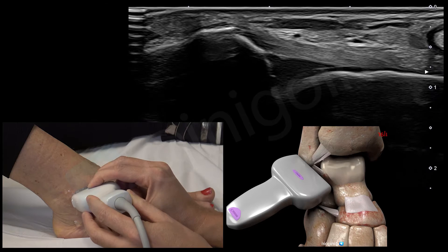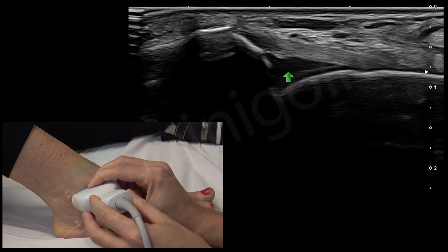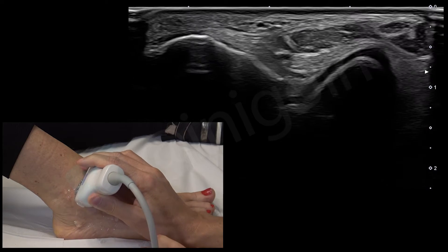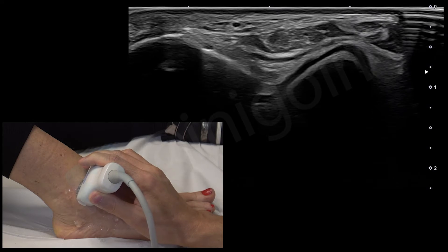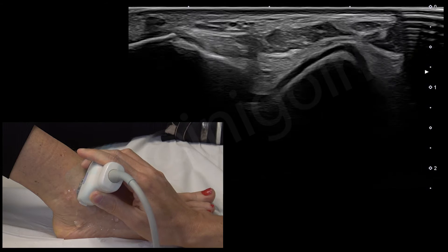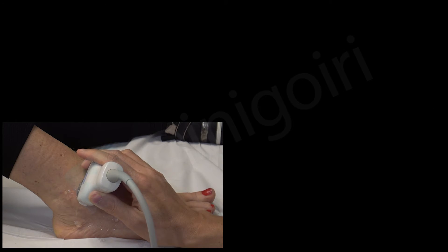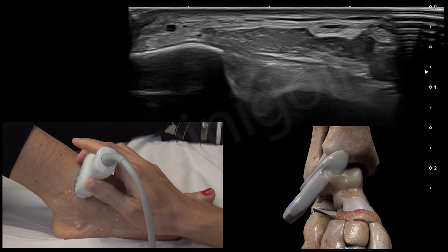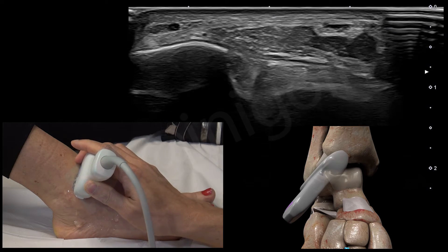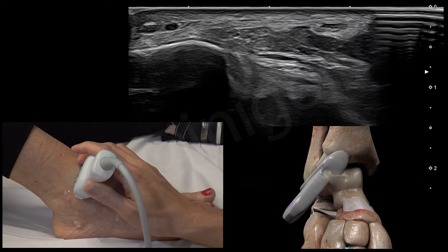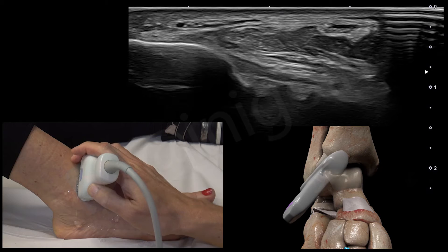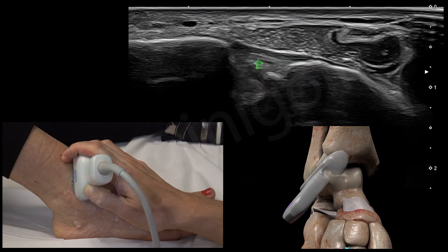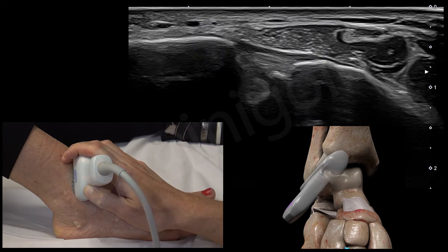Once we have checked this ligament, notice below the ligament there is the joint — this ligament is a reinforcement of the capsule. Then we move the probe 45 degrees upwards without losing the fibula. We have on the left the fibula and on the right the talus at a 45-degree angle of the probe. As we go upwards, the talus disappears and the tibia appears with this small ligament here. This is the inferior component of the anterior inferior tibiofibular ligament, and as we go upwards, the superior component here — this is the anterior inferior tibiofibular ligament.